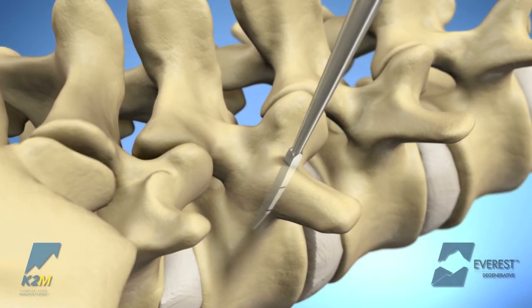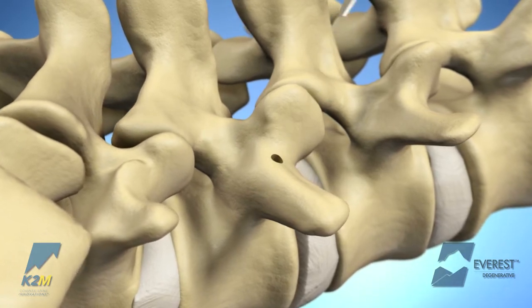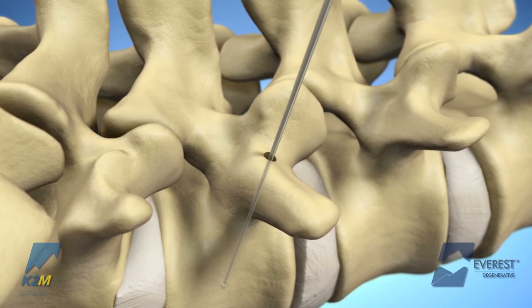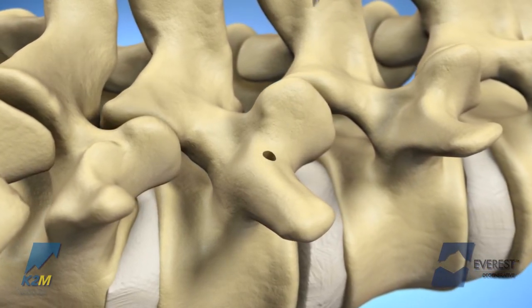The entry point is cannulated with the curved or straight probe, and the probe is advanced to the appropriate depth as determined by the surgeon. The prepared pathway is sounded with the ball tip feeler to verify that the walls of the pedicle have not been violated.